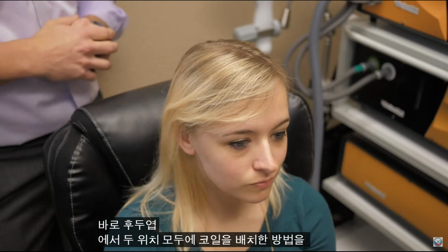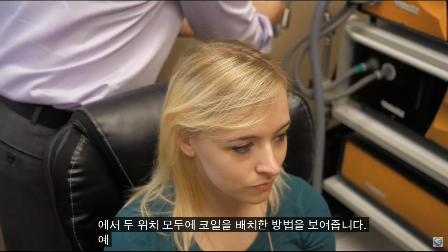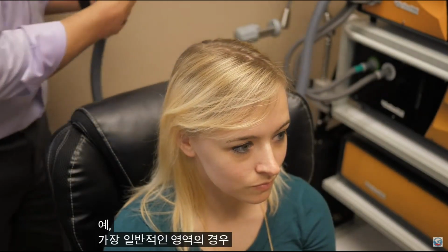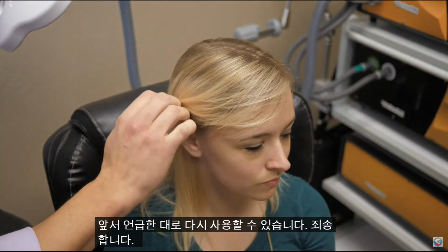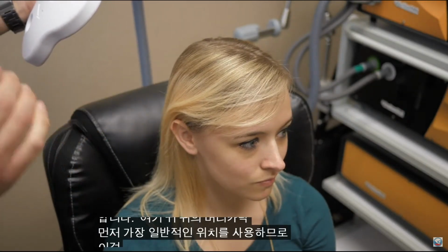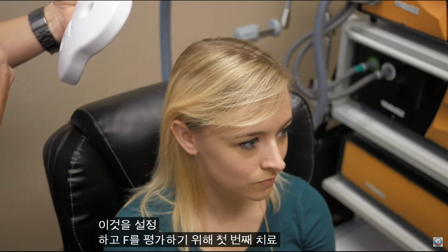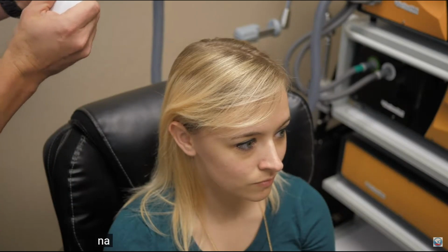Can you show us how you place the coil for both of those locations? Yes, so for the most common region, we will typically just take the coil, and you can use it again, as I mentioned. Sorry, I'm going to move your hair behind your ear here. We'll use the most common location first, and so you will set this up and you can deliver the first treatment to assess for whether it's going to be something that the patient's going to respond well to.